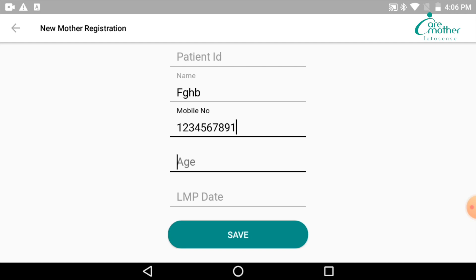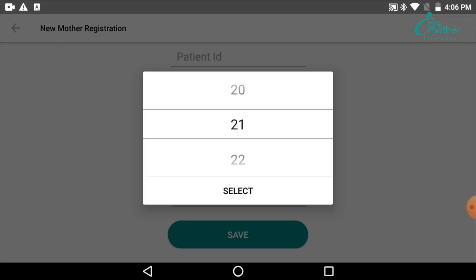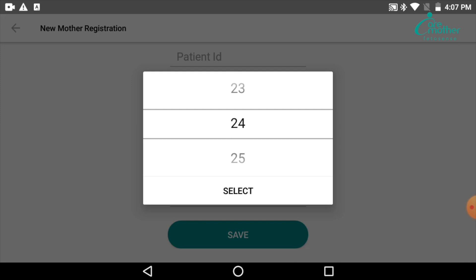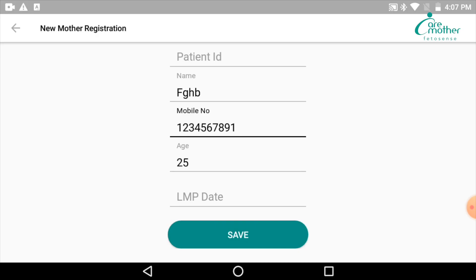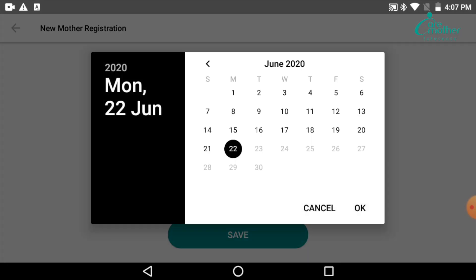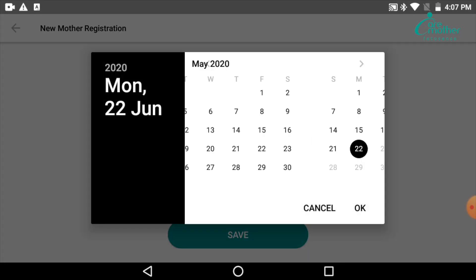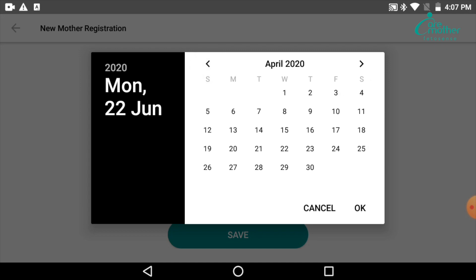Next, you put in the age of the patient. It has to come in the middle line between the two black lines — we slide it to the correct age, for example 25 years, bring it to the middle line, and say Select. The age is entered. The last thing we need to enter is the LMP of the patient. We open the calendar, go back to the LMP date, select it, and say OK.